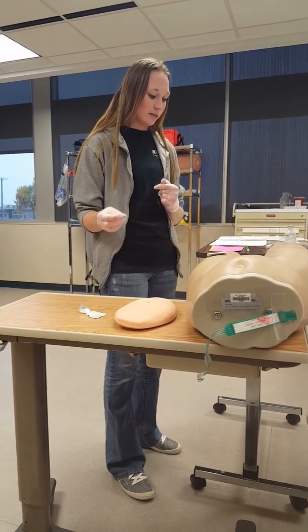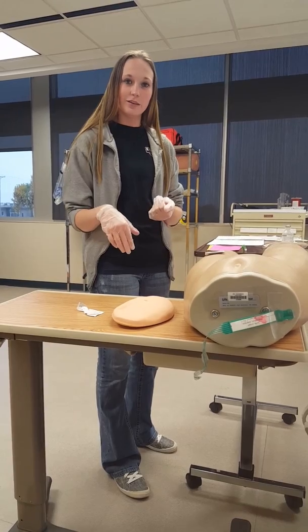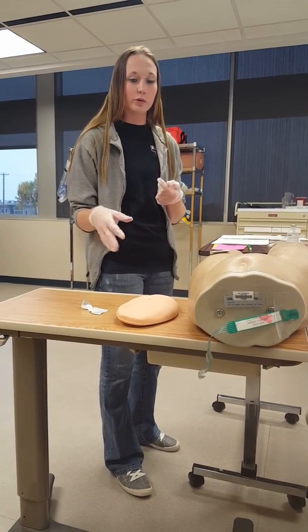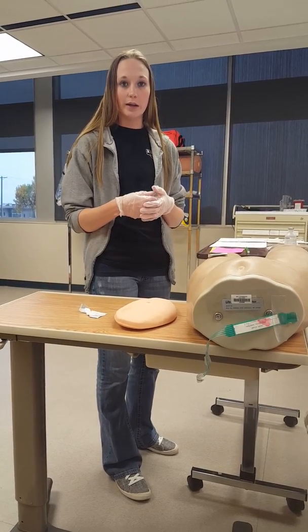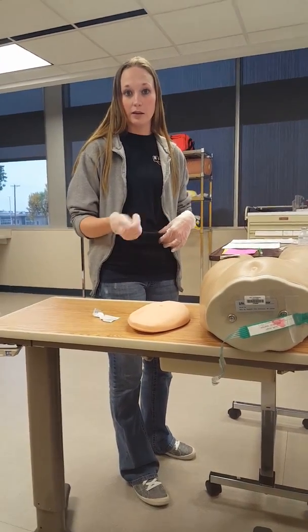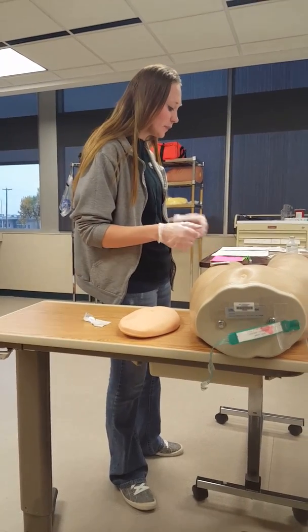And also, being that you're a pretty fit person, I would go at a 45-degree angle, but if you're a bigger person, I would do a 90-degree angle, and I would be pinching your skin as I am doing it.